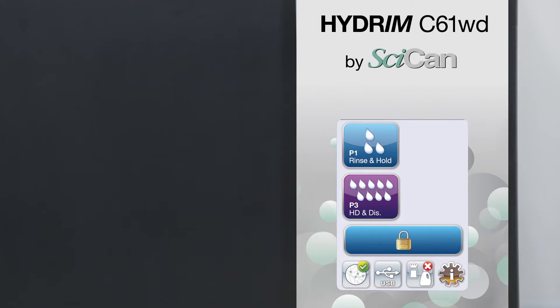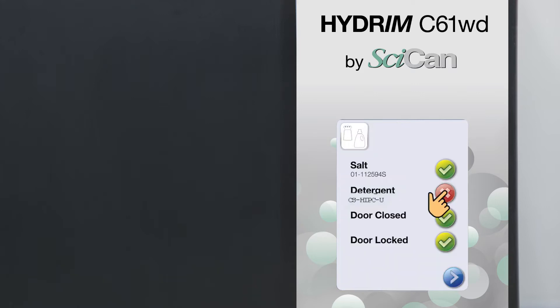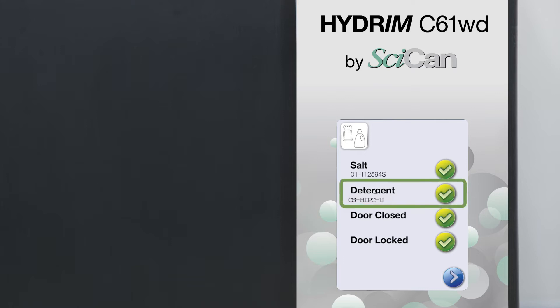To prime the cleaning solution dosing pump, press the water softener detergent icon on the main screen. In the water softener detergent screen, press the red X next to detergent. The unit will prime the dosing system and a green checkmark will appear in place of the red X when it is ready for use.